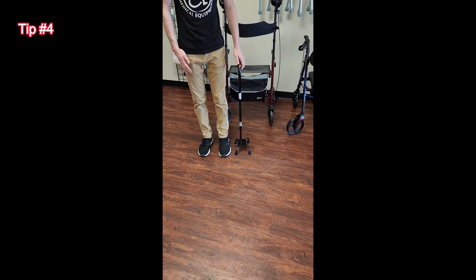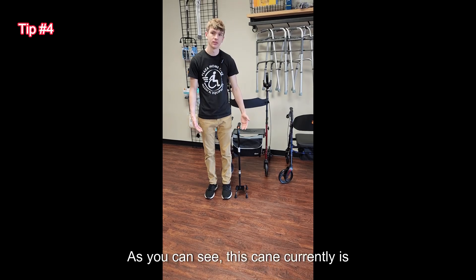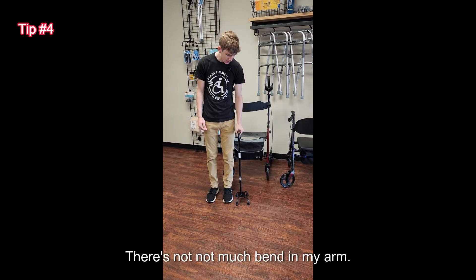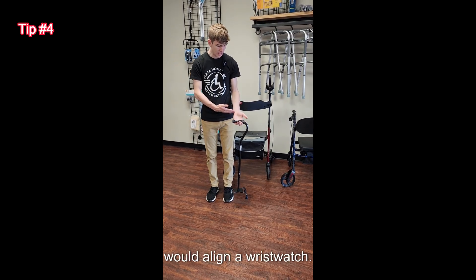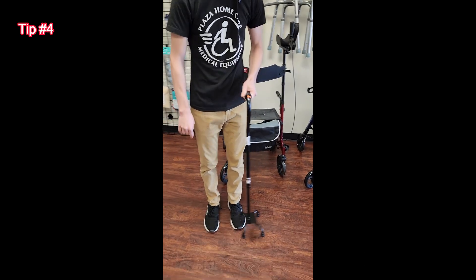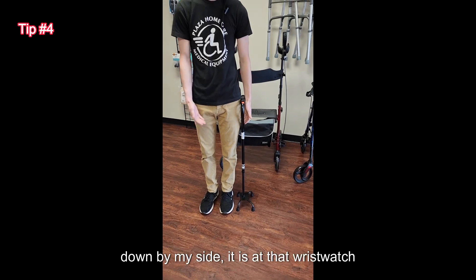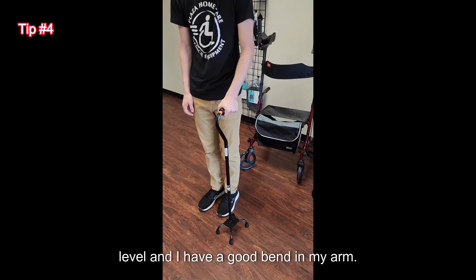Now let's talk about where to adjust the height of a cane. As you can see, this cane currently is pretty low — there's not much bend in my arm. You generally want to have it where you would align a wristwatch. So I will adjust it to there, and now if I put my hands down by my side, it is at that wristwatch level and I have a good bend in my arm.